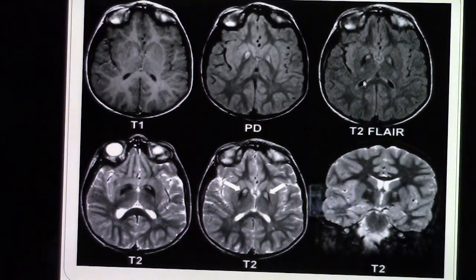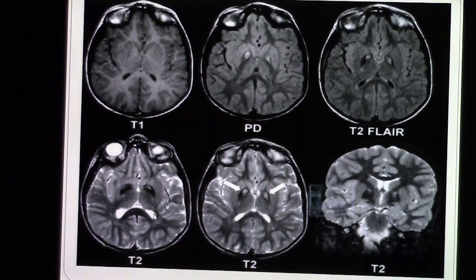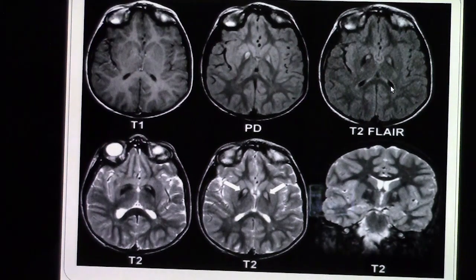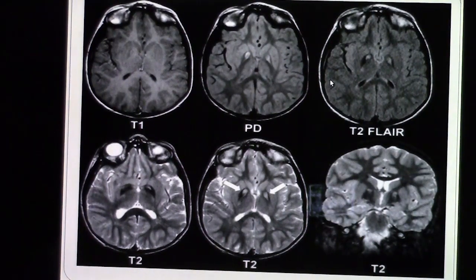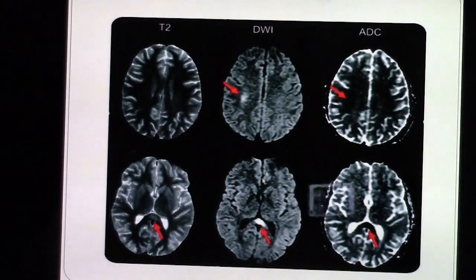On FLAIR, the fluid signal is wiped out, so it does not look bright as in the classical T2 cut. In the classical T2 cut, the fluid signal is bright. In the FLAIR image, it will be suppressed so you have a more clear image of the gray and white matter. These are the main cuts for the brain MRI, and there are also additional cuts used regularly.